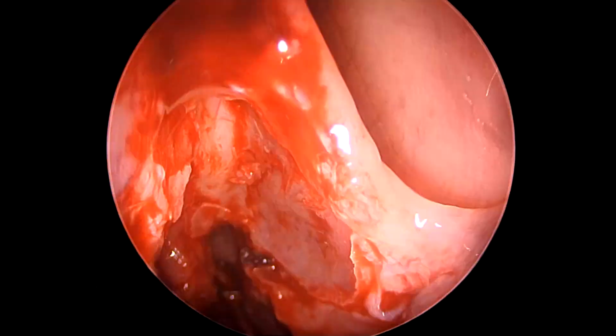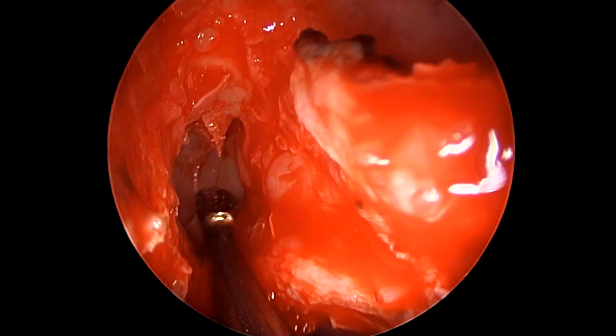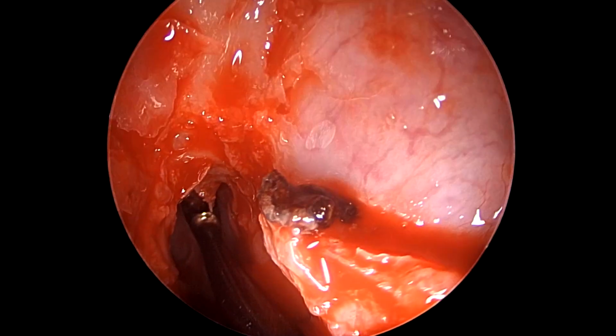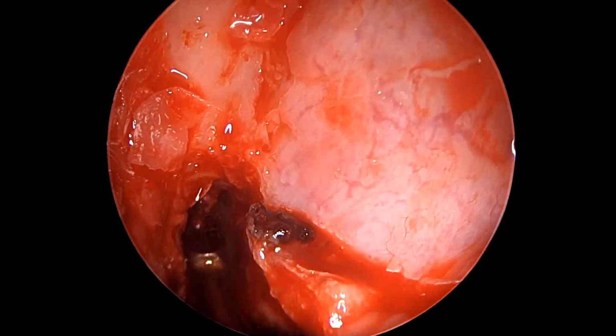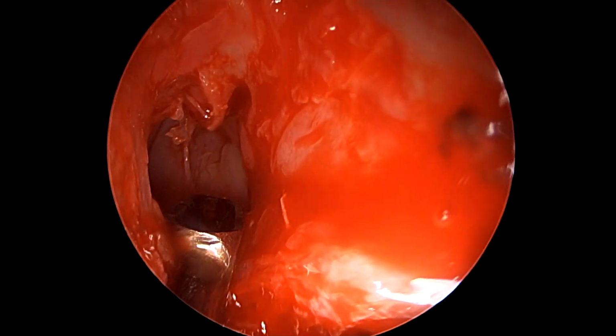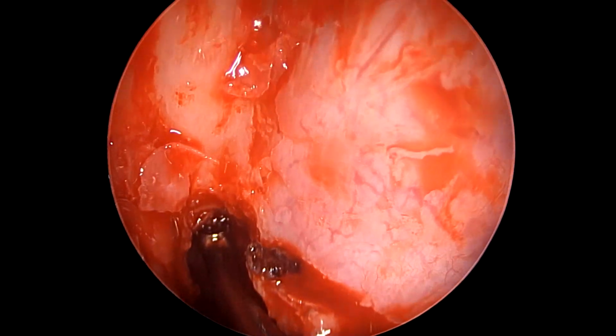Now this is extremely skewed vision because we're using the 70-degree camera to see upwards, and now we are actually breaking the wall of the large T3 cell, which is occupying 50% of the height of the frontal sinus, and we are trying to break that as well to be able to see inside the frontal sinus proper.